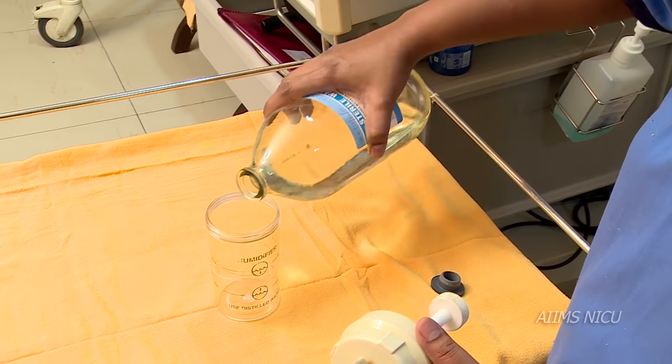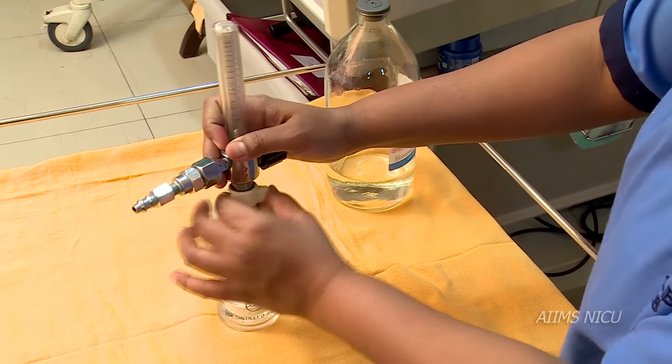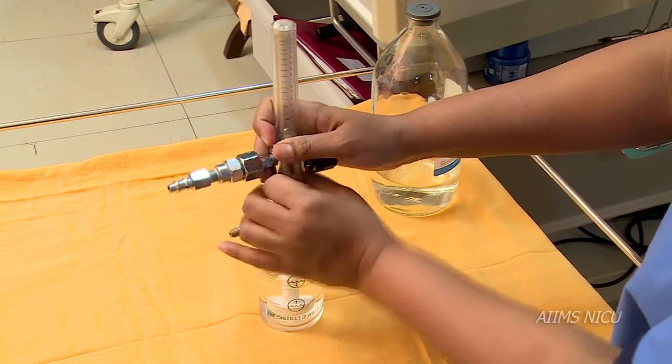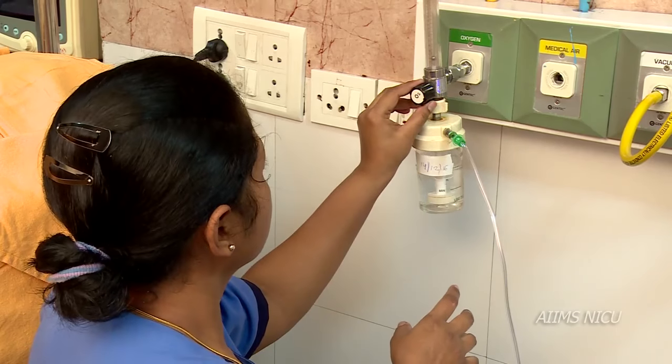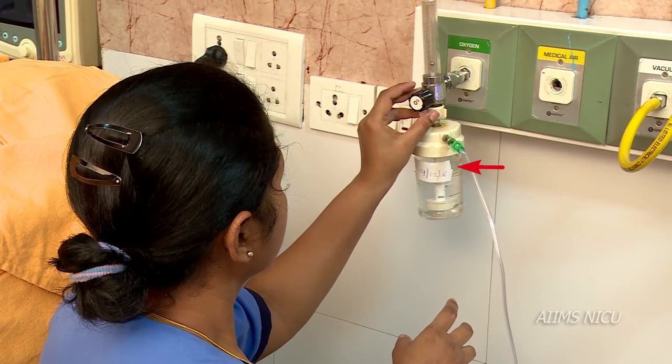Fill the humidifier chamber with distilled water to humidify the delivered oxygen. Put the date on the humidifier chamber and check for bubbles in the humidifier chamber.